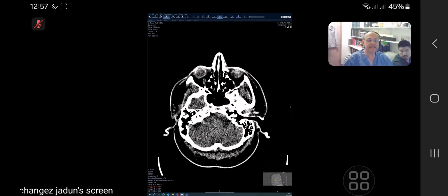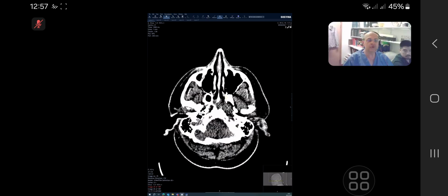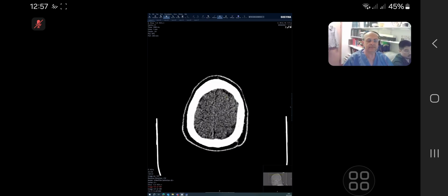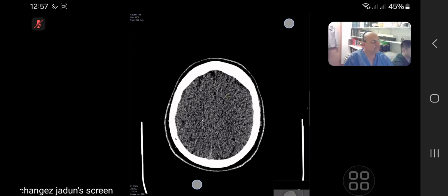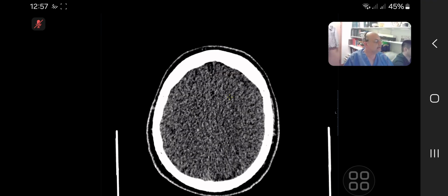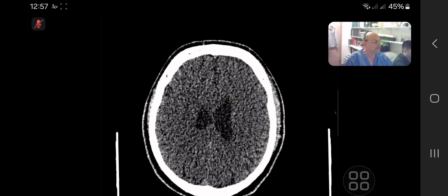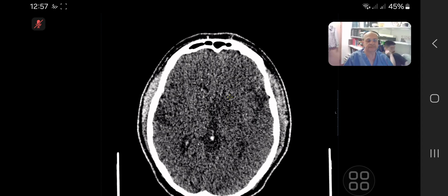So there is a volumetric CT scan that got done, and that is the CT you are seeing. The optician is querying any demyelination or compressive lesion or any pathology that explains the left eye vision change.